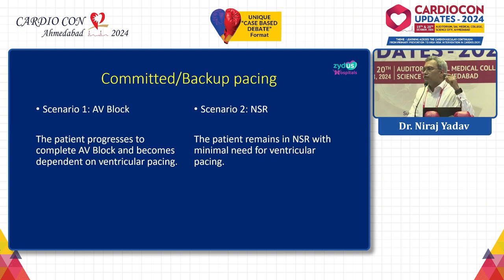So unfortunately, if you are implanting a CRT, we have to think of 2 scenarios. Number 1, the patient progresses to complete AV block and becomes dependent on ventricular pacing. In that case, probably CRT is fine. But as in this case, where the patient remains in normal sinus rhythm most of the time, there is minimal need of ventricular pacing. You are introducing dyssynchrony in a patient who has normal LV size and only an apical scar. So this patient is going to get worse with CRT.